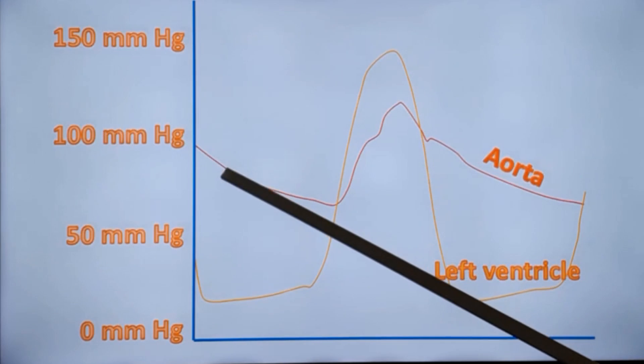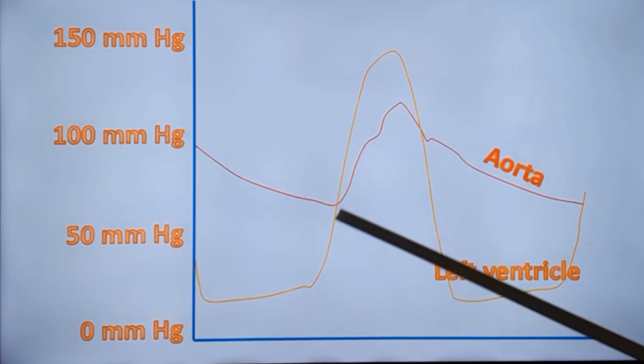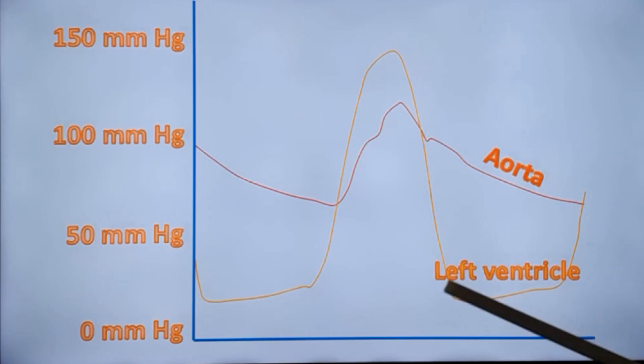And this red tracing is the pressure tracing from the aorta, while the yellow tracing is the pressure tracing from the left ventricle. This is the systolic portion, and this is the diastolic portion.